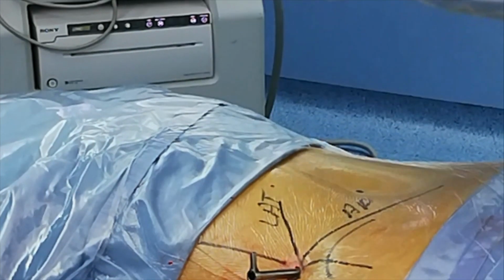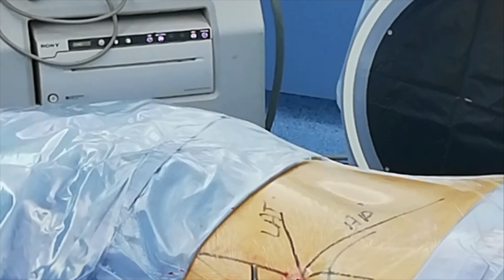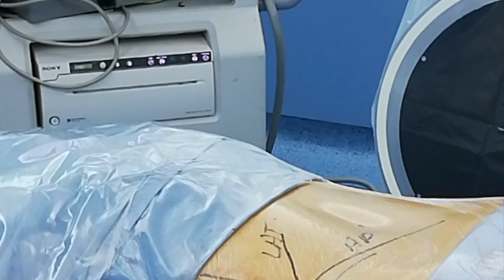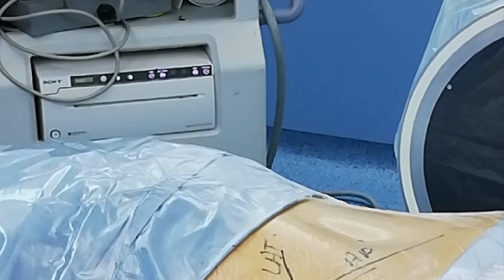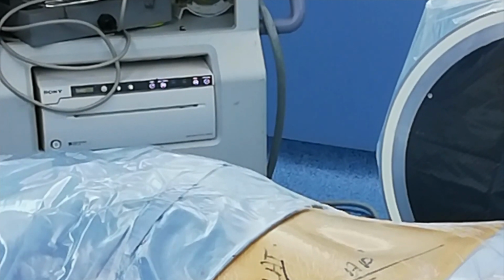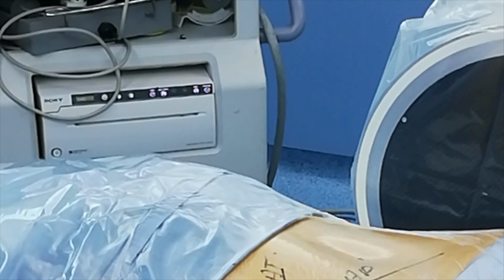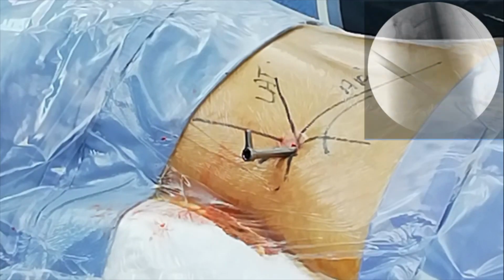So on the AP, it's very critical to always think where your cannula tip is. So on the AP, I am where I want to be in the recess, just medial or at the medial pedicle wall of L5. And on the lateral, you want to be exactly in the recess. So in that caudal part of the foramen, not in the disc space. This is all about technique. So the pathology is in the canal, so we're going to go in the canal in the recess. X-ray.